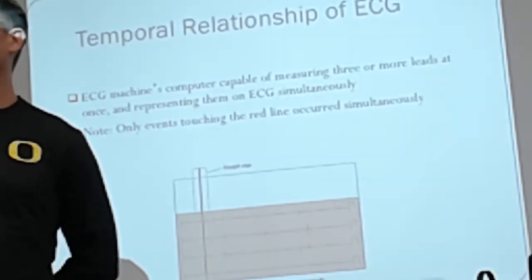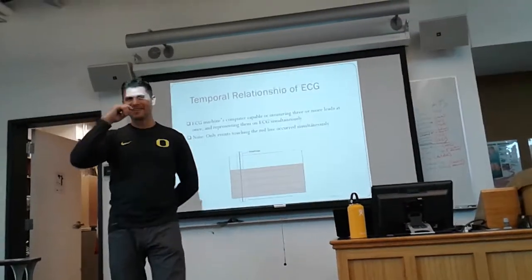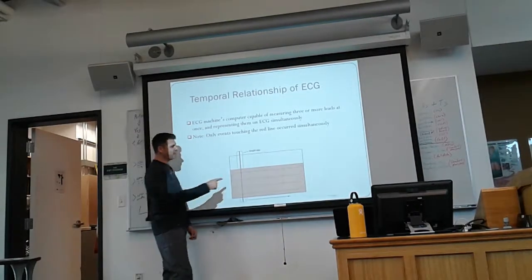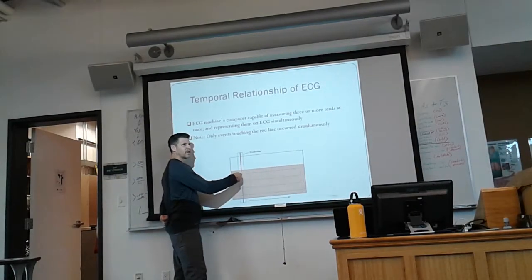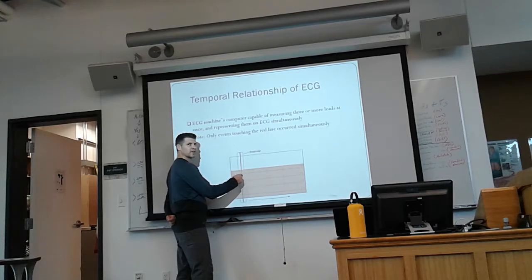Okay, so what happens if I have a P wave right here, and I don't see anything right here in lead two? Lead one shows me a good clean P wave. Lead two doesn't show me anything at all.